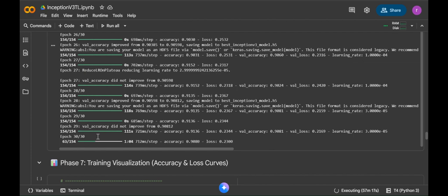In our research, we implemented and compared 4 supervised learning models. First, we developed a baseline convolutional neural network (CNN) model from scratch. This served as our foundation model to understand how basic CNN architecture performs on this dataset.